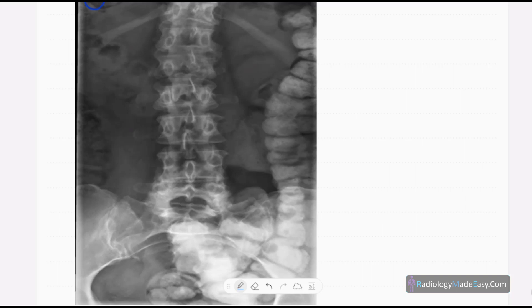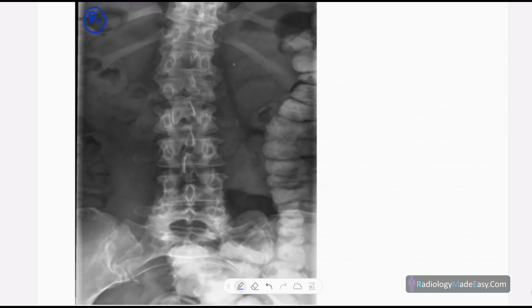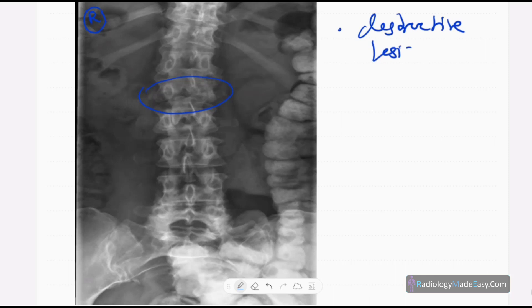This is the anteroposterior projection. Apart from the barium enema contrast in the sigmoid colon and descending colon, there is an abnormality in the vertebra. You can see there is destruction — a destructive lesion in the left pedicle of the L2 vertebra. This gives the appearance known as the winking owl sign.